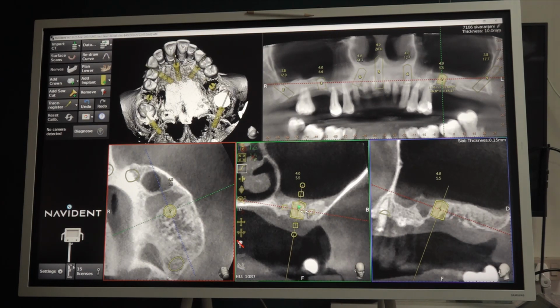But we should not have very high hopes on those implants. It is better we tell the patient beforehand, or after surgery you can tell. We have placed in between 2 very short implants, they are just additional implants. If it becomes loose, we may have to remove it during the scanning itself, right? We don't know, because when you put the scan body and remove it, it may come out.